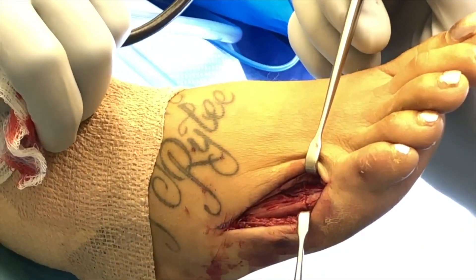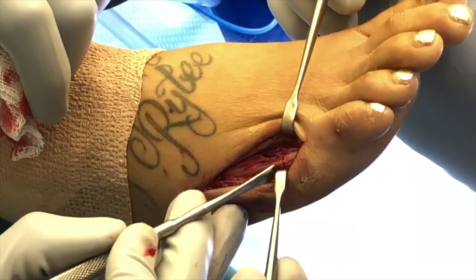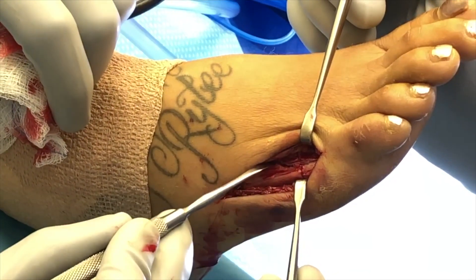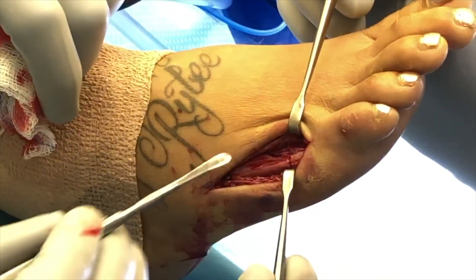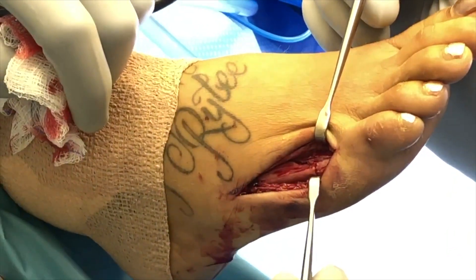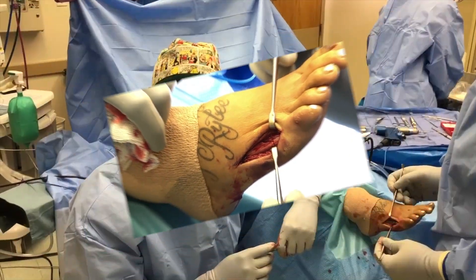It's oriented coming up this way and then it actually exits out the side of the bone. Pretty much all fractures follow the laws of physics so they come in a direction — this one probably started here and worked its way down the bone. We'll get this guy clamped together with a screw across it to compress it nice and tight, and then we'll put a plate over top of it to protect it so she can weight bear early.